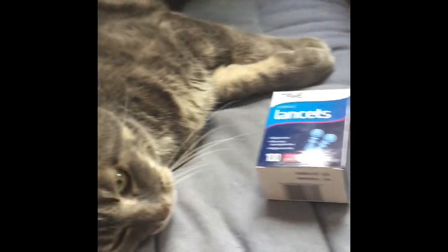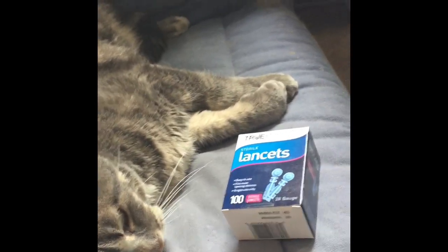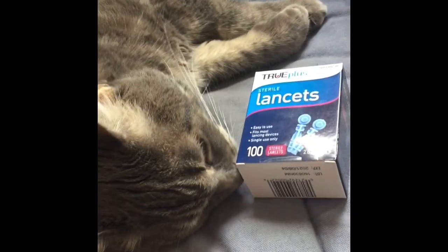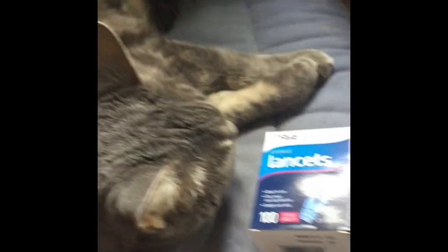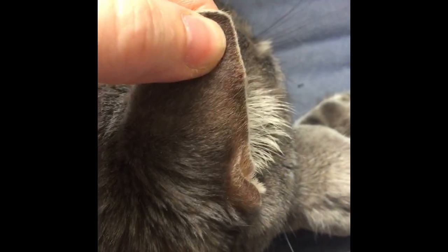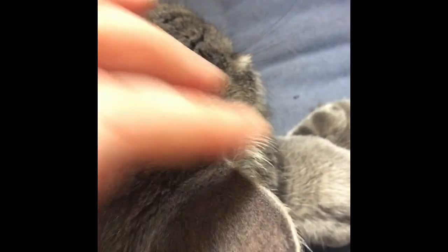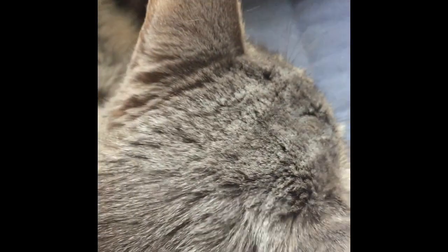Some of the meters will come with the device and I find that the cats really think that the clicking noise is unpleasant. So I would just skip the device altogether. Plus you can be a lot more accurate with where you do the poke so that you don't hit the vein by mistake. Some vets tell you to hit the vein. The vein runs really close to the edge. You don't want to do that actually because it hurts the cat more and it bleeds way more than you really need.